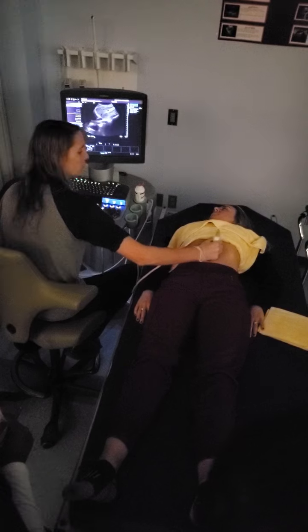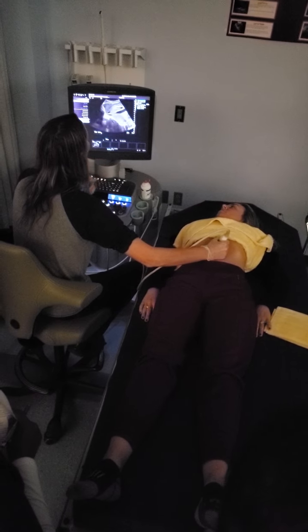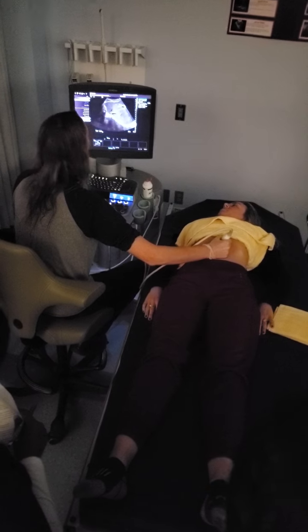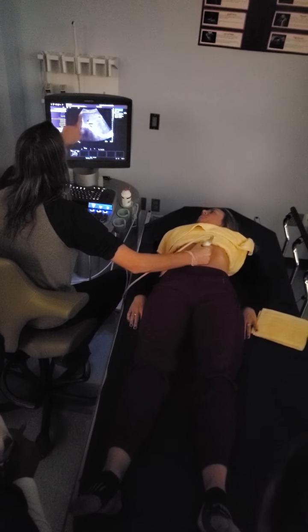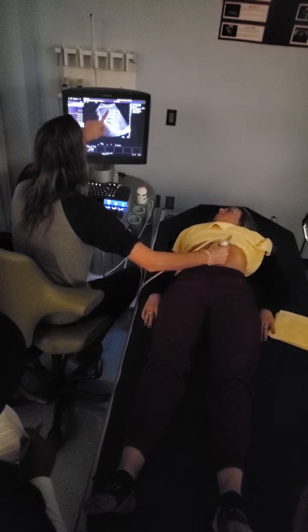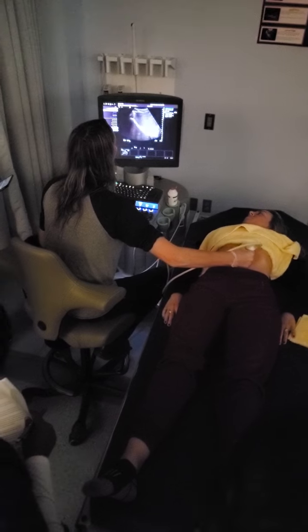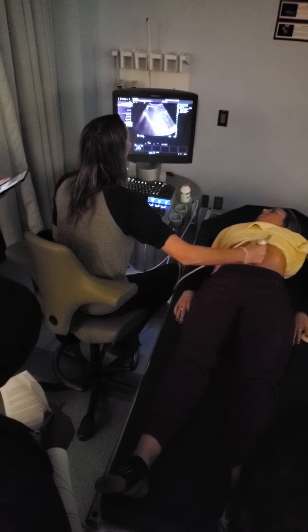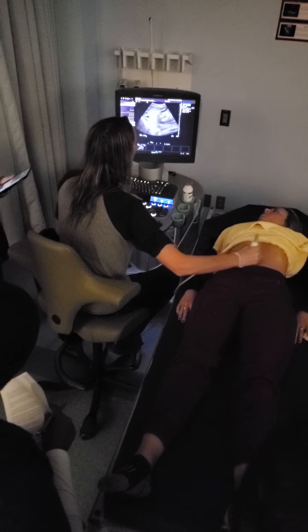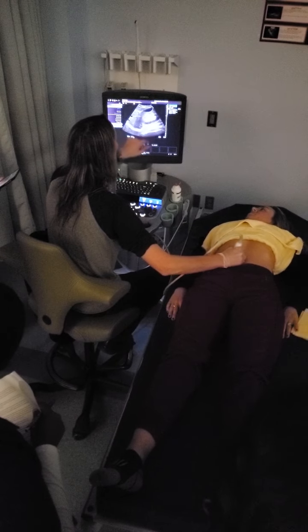So I'm going to do the sweep for you first. So here we are at the IVC. I'm going to angle just slightly to the left of that, or right of that IVC. Here's my superior border. You'll notice our inferior is cut off. So we're going to go anterior, posterior, superior, inferior. We're going to sweep all the way through, looking for hairy scaries, and we're going to take our 4 images. Then we're going to come down and angle to see that inferior, gallbladder, right kidney.